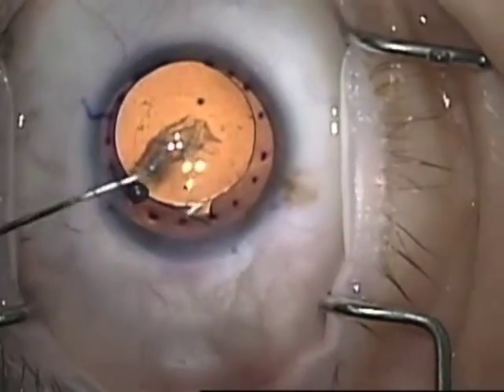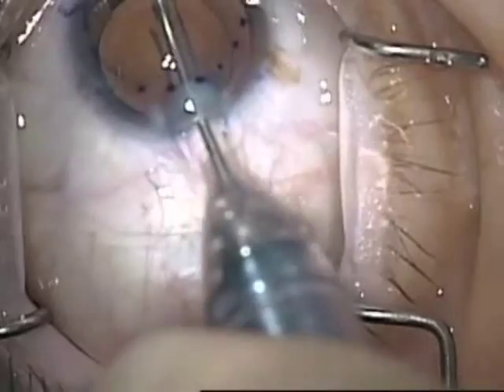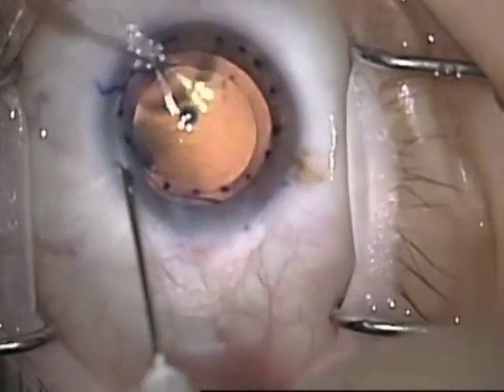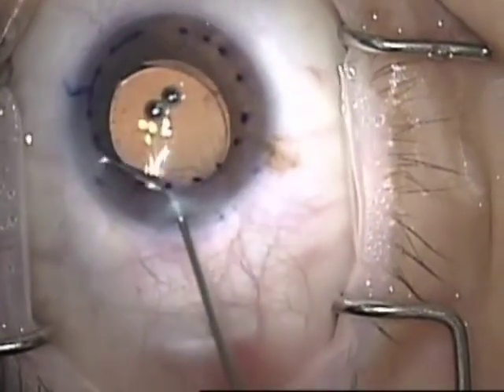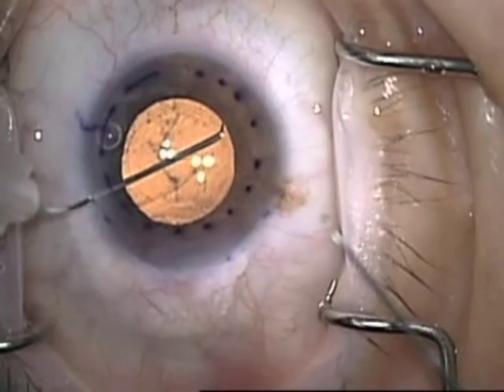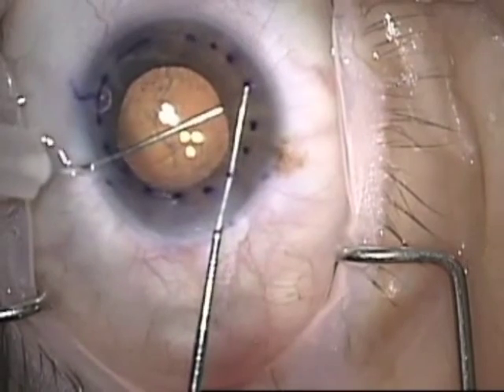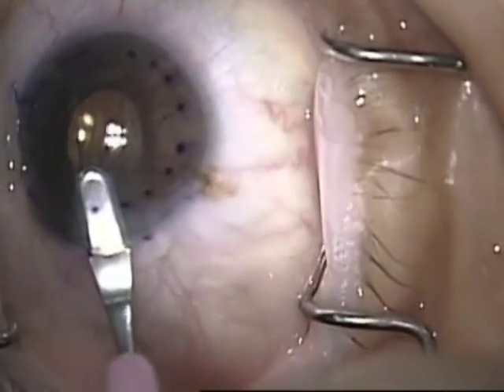I'm removing that graft, getting it in nice and central with the Reverse Sinski hook. Once it's free, I'll remove that with a pair of Utrata forceps and pass it off to pathology. Then I remove absolutely all of the cohesive viscoelastic and use Miochol to bring the pupil down along with gentle stroking of the iris. Then using a bent 30-gauge needle — I bend the tip in the shaft so I can easily place it behind the iris — I scratch down onto it with a Sinski hook to make my peripheral iridotomy.